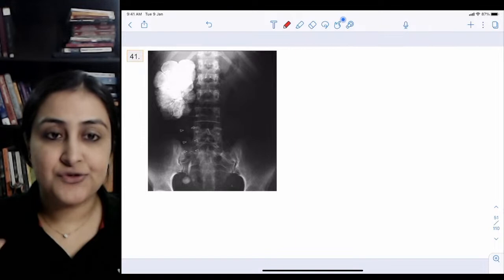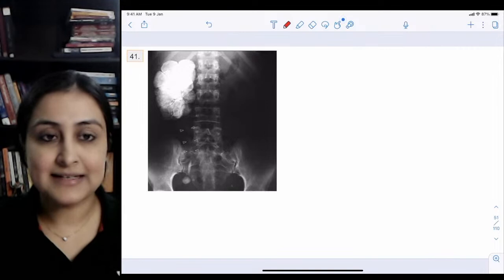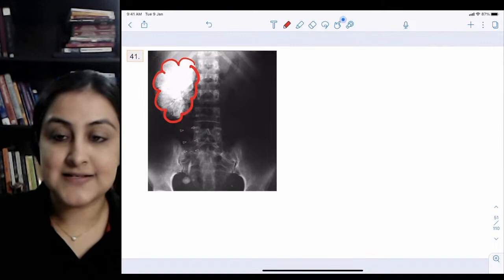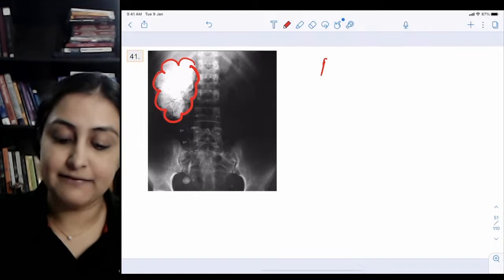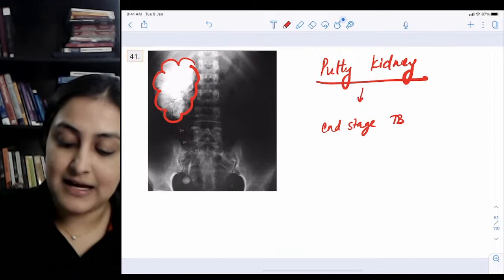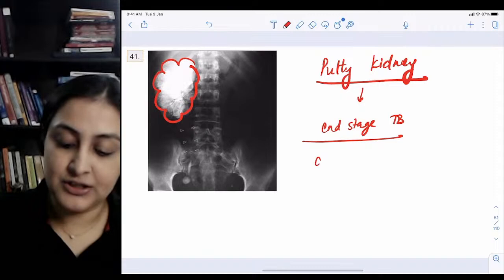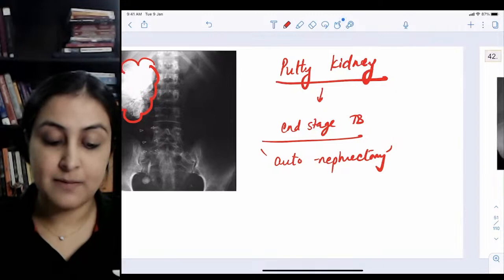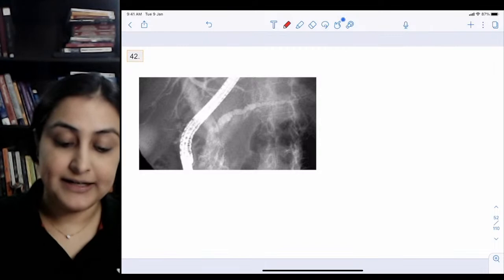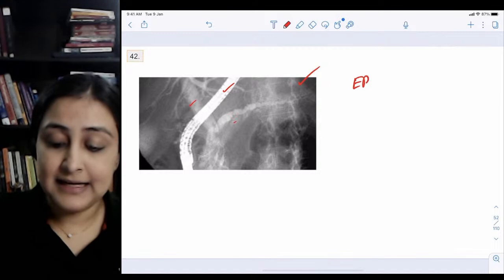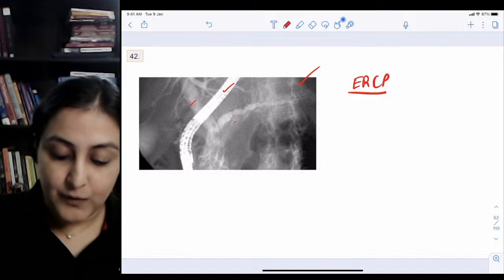Changing from brain infections to kidney infections - the same organism can involve any organ. This abdominal X-ray shows a completely white calcified kidney - a putty kidney. This is seen in end-stage renal tuberculosis. A completely calcified kidney has no function, and this is called autonephrectomy - the body has essentially killed the kidney. So putty kidney equals end-stage renal TB equals autonephrectomy.